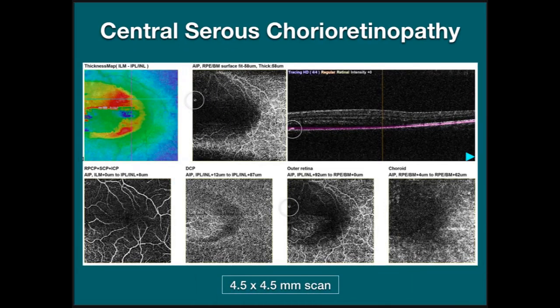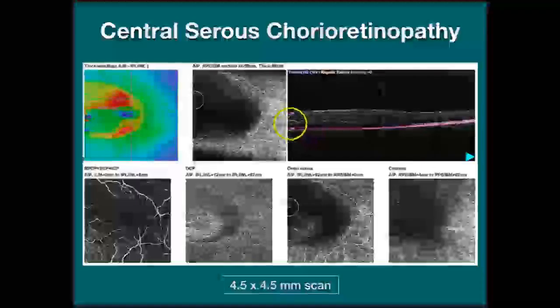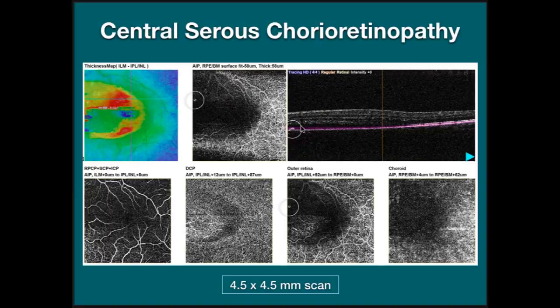So let's perform OCT angiography on that area. With the NIDEK, you can actually go through a cross-section that was taken through the OCT angiography, find the area of interest. So I've located the PED, and you can also locate it on the full thickness slab that goes from the RPE down to Bruch's membrane. What I've done is I've formed a very small slab here, and we can locate the new vessel just at the RPE, just inside the retina.